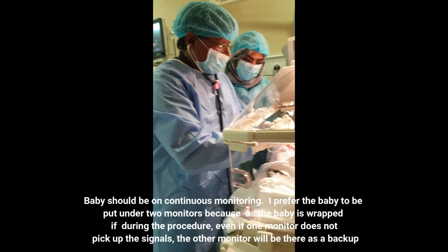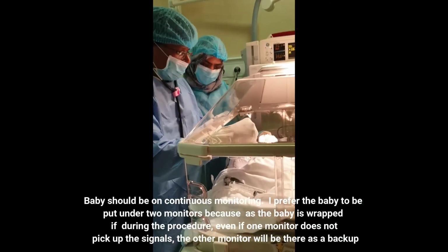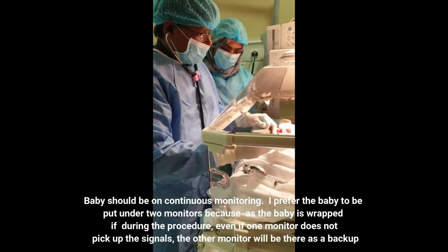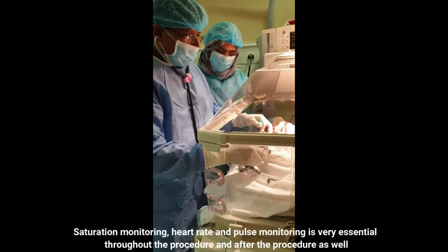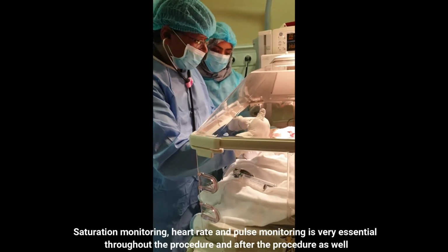The baby should be on continuous monitoring, and the baby should be put on 2 monitors continuously, as even if one monitor is not picking up the signals, the other monitor will be there to monitor. Saturation monitoring, heart rate and pulse rate monitoring is very essential to the procedure and after the procedure as well.